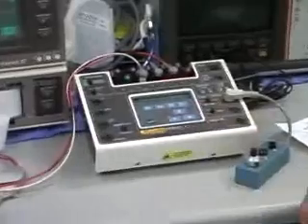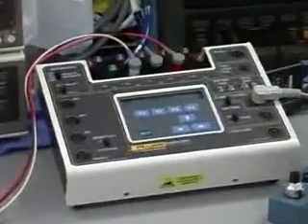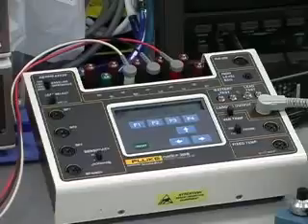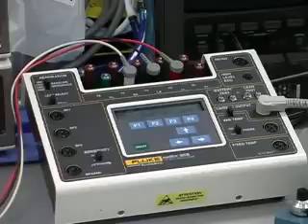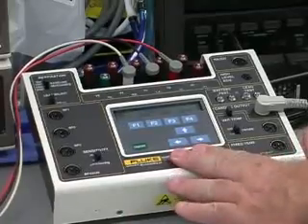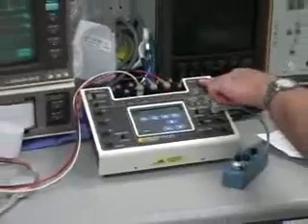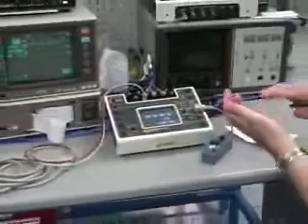It's really more a matter of figuring out what you want to do with the monitor and then saying, okay, now I'll just have to come back to my simulator and find the function or look at the different menu for that. As you can see, we've done a lot of button pushing on this thing. We also have a new little handheld controller. It plugs into the RS-232 and controls the simulator via a keypad.